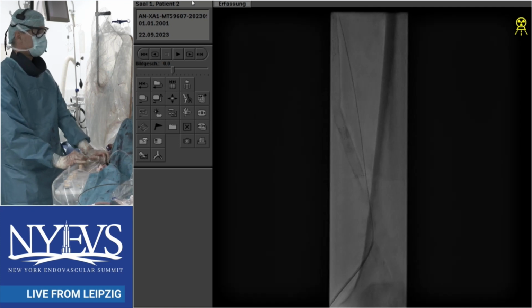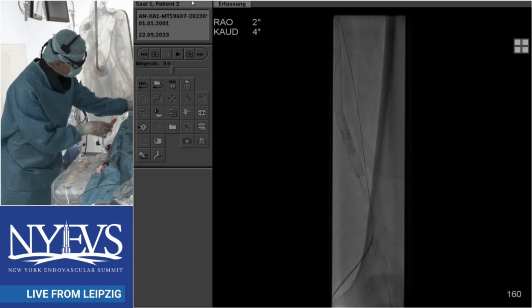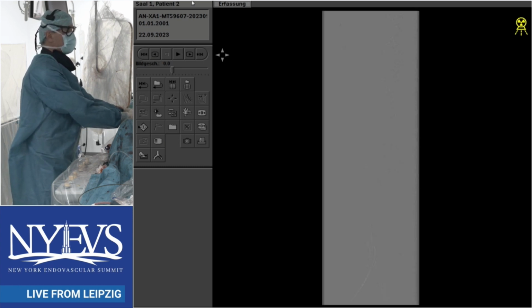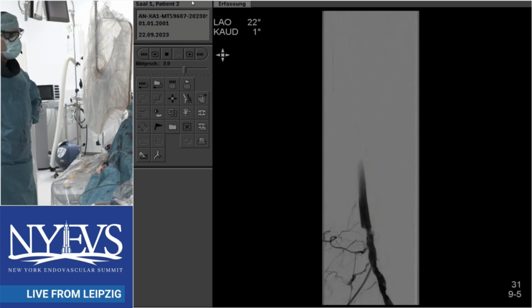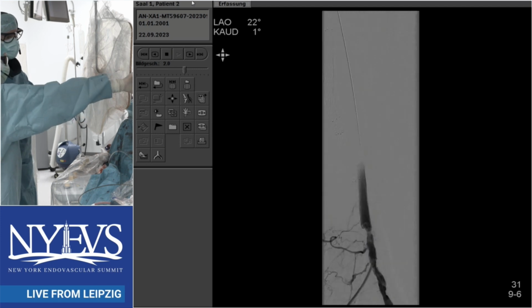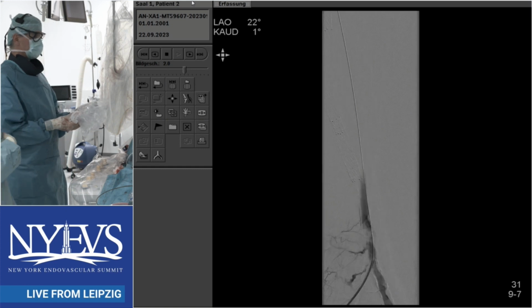So my approach is: why did the venous bypass fail? It was a bad segment, a compromised segment, or a distal anastomosis issue. You would hope in the surveillance of that, and this is August 2023, so it really failed a month ago, I will try to revise it and rescue the venous bypass. Although when you rescue a venous bypass, the outcomes are actually not particularly good, and if you don't detect any technical issue, the outcomes are even worse. Once you put in a venous bypass, you're really committed, like a long-term relationship, to keep it and care for it. I will be concentrating on that.